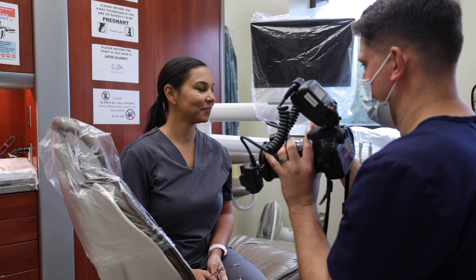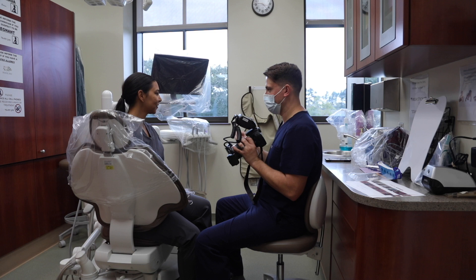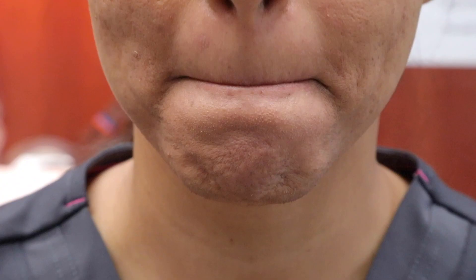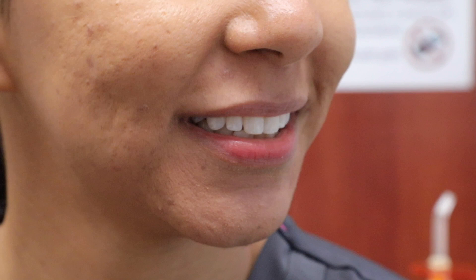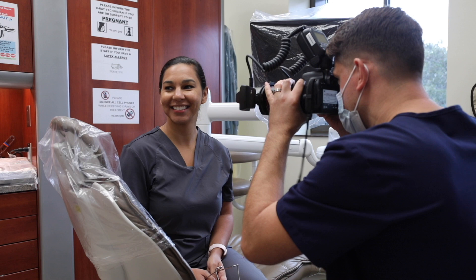These are two images where the patient turns 45 degrees left and right while smiling. When the patient turns, they should turn just enough so the lateral incisor on each side is pointed directly at the camera. Just like the up close smile, the patient is smiling for both of these images.